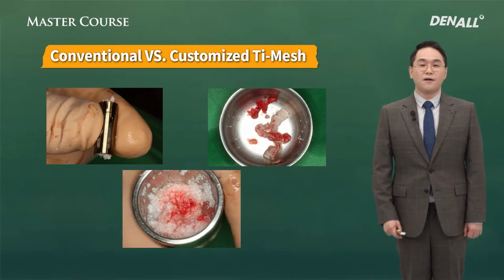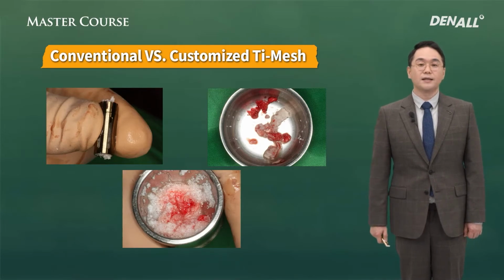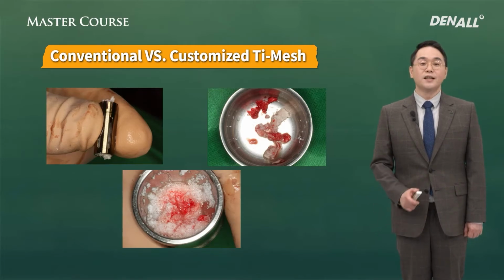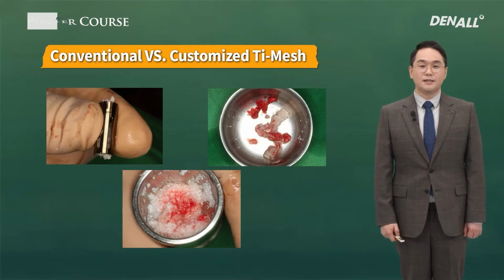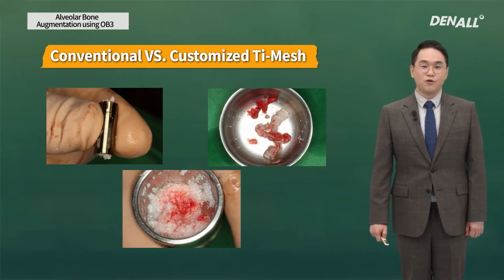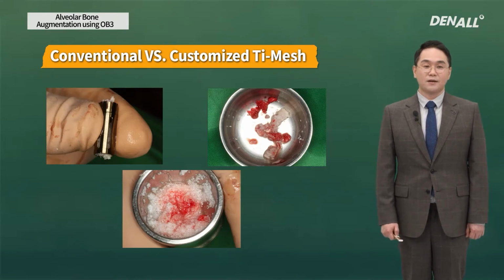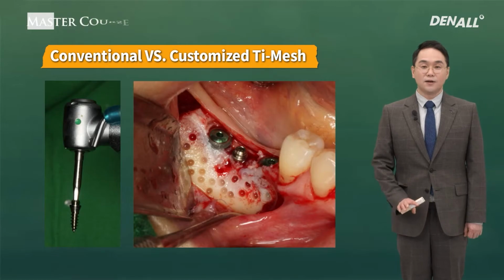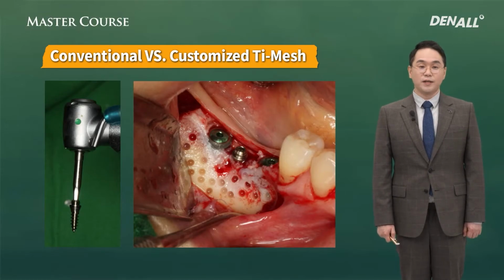Using an auto bone collector from the ramus distal to 47, from the buccal area, autogenous bone is harvested and is mixed with xenograft material 1:1 ratio between number 46 and 47 implants. The tenting screw is placed to connect to the Jawbuilder.